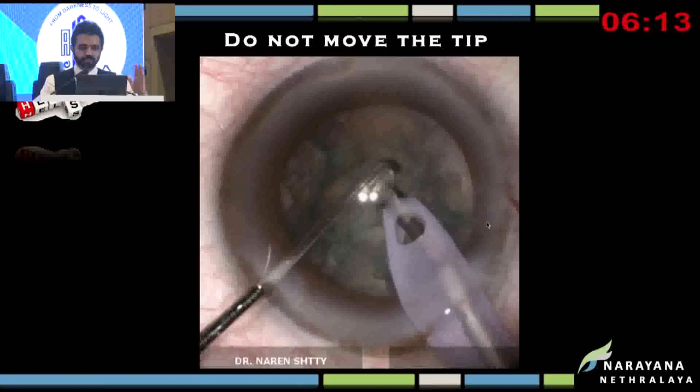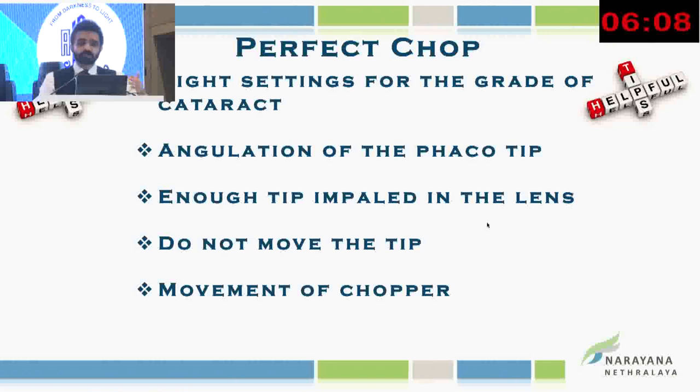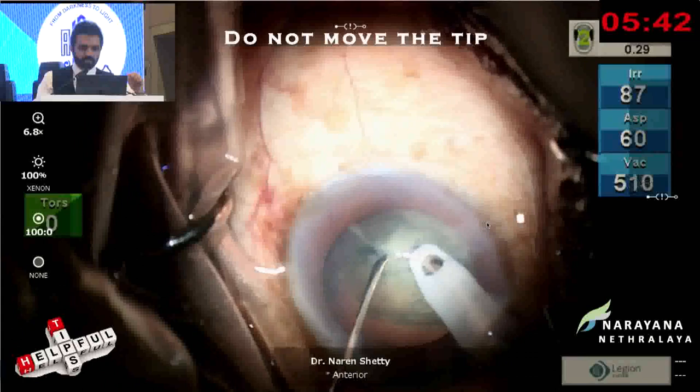The next thing is, how do I move the phaco chopper, or how do I chop the right way? See, a lot of people do different techniques. You don't need to do long strokes, meaning take the chopper to the periphery, take a long stroke, and then chop it. Keep it very simple and nice. Just take the chopper just in front of the tip, and then pull it towards the tip, and then move it sideways, okay? I'll just show you how that works. The video's playing.